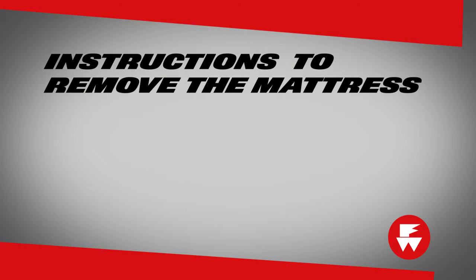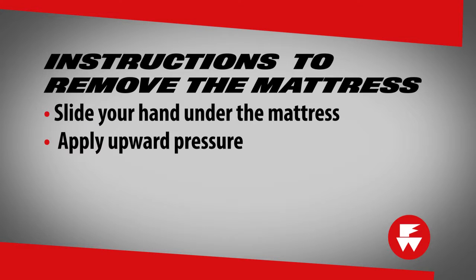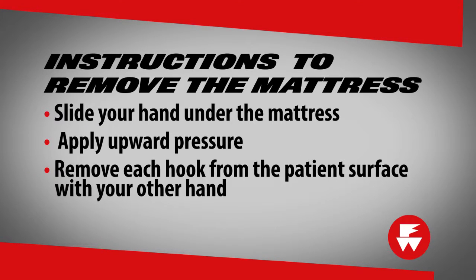To remove the mattress, slide your hand under the mattress and apply upward pressure while removing each hook from the patient's surface with your other hand. You can separate the hook and loop fastening strips if you selected that option.